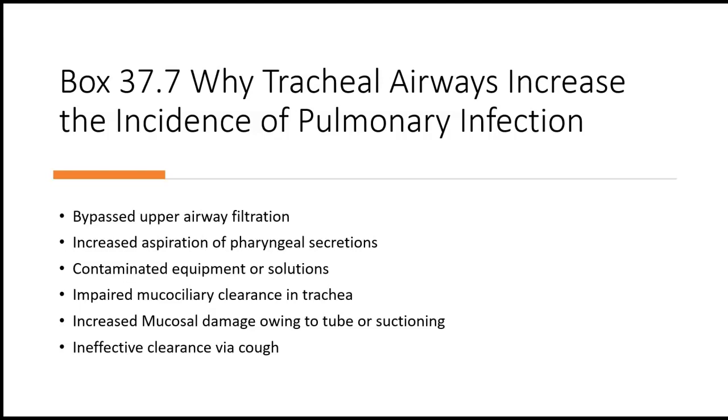So a lot of people will be doing procedures with the patients and then using their dirty gloved, contaminated hands to touch the touch screen on your ventilator. And you'll also notice people coming into the room to quickly silence alarms and not doing proper hand hygiene, touching the dirty vent surface. So it's any high touch areas in patient rooms. I always think it's a good practice to make sure you're disinfecting those daily. I know housekeeping comes in and cleans the rooms, but we're all a team and we all share responsibility with this stuff. They're going to be nervous about touching your equipment, so they're probably not going to wipe it down for you, which is good because you need to be careful about what you put on your touch screens.